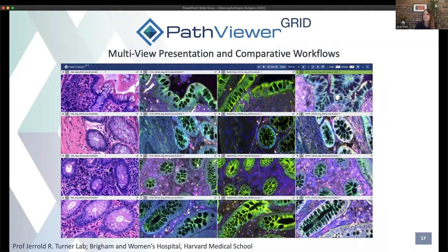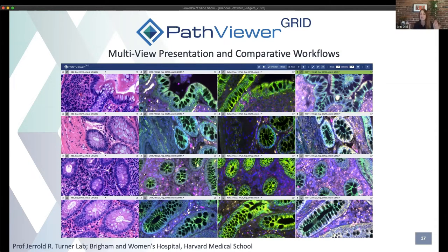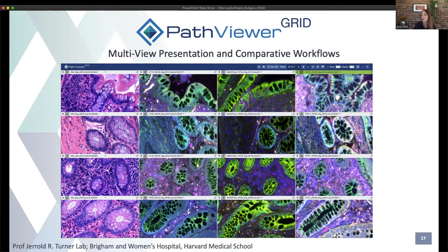We also built PathViewer Grid — the partner application to PathViewer — which is like many PathViewers in one. It's a grid of multiple PathViewer windows so you can view many images side by side and synchronize navigation across views. As you zoom and pan, you see the same changes in other views. This is useful for serial sections, or viewing an H&E image and a fluorescence image side by side. You can annotate one section and copy-paste annotations to all views. These fluorescent images are from Jerry Turner's lab at Brigham and Women's Hospital, Harvard Medical School, from their public OMERO Plus instance.